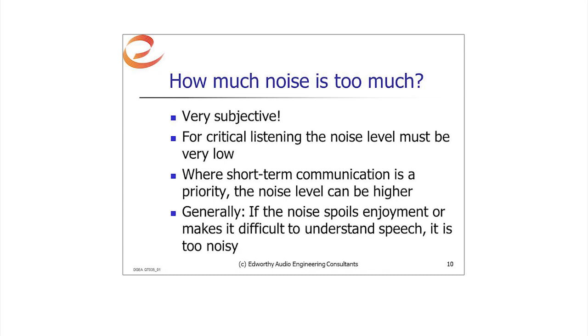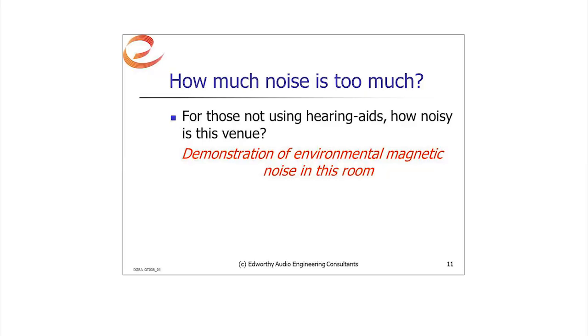But if the loop system is going to be used for short-term communication, perhaps at a ticket office, a teller's window, an inquiry desk, then the noise could be higher and still be acceptable. Because in a short-term communication where it's one-to-one, you have the opportunity of asking the person to repeat what they've just said if you haven't been able to understand it. Generally, if the noise spoils enjoyment or it makes it difficult to understand speech, then it's too noisy. But as I say, this is very subjective.